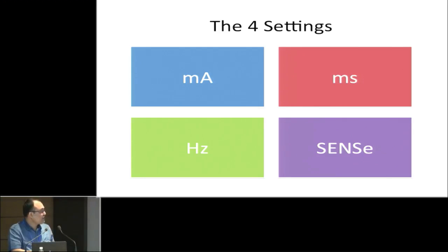And the newer machines are coming with a SENS technique, that is, sequential electrical nerve stimulation. Here, what we apply is a first 0.1 millisecond current, a second 0.1 millisecond current, and a third 0.2 or 0.3 millisecond current. So the third one will be a longer duration current. It will give a path to the anesthesiologist, showing in which direction the needle has to go. And once you are near the nerve, there will be 3 contractions, tuck, tuck, tuck, like 3 rhythmic contractions.